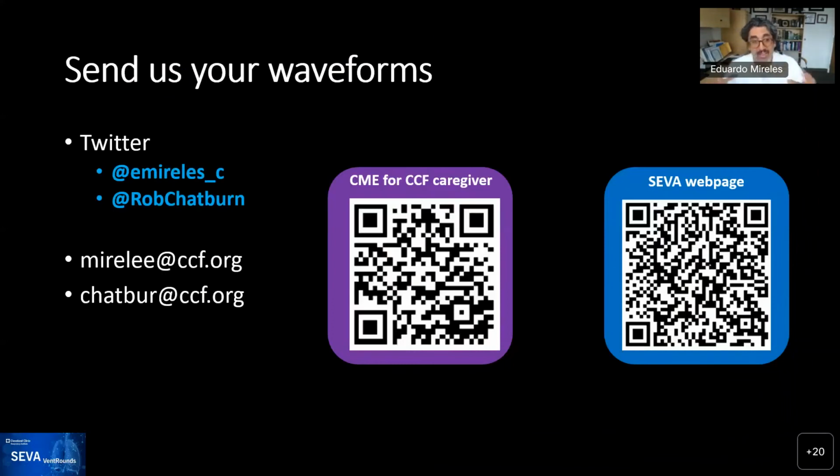This was the end of the basic tag use. Starting next week, we're going to go into the modes and start to read them a little bit more. We're going to go into load and how to interpret the physiology from the waveforms. All right. In 2 weeks, that's correct, Hara.